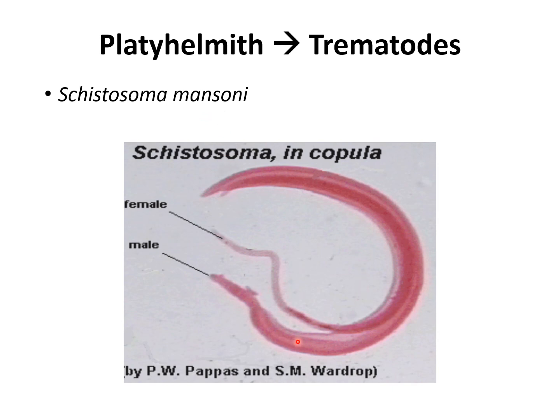Now, there is a female worm and there is a male worm. So those two worms are definitely separated from each other. So there's a female and it's going to have the female reproductive parts, and then there's the male and it's going to have the male reproductive parts.